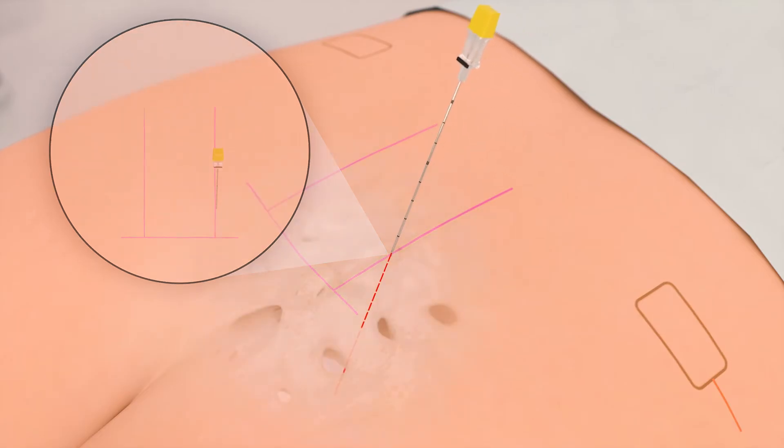A needle entry point that is too cephalad on the skin results in a needle angle going toward S4 which could result in an S4 motor response. Conversely, an entry point that is too caudad will result in the needle angle going toward S2 and could cause an S2 motor response.